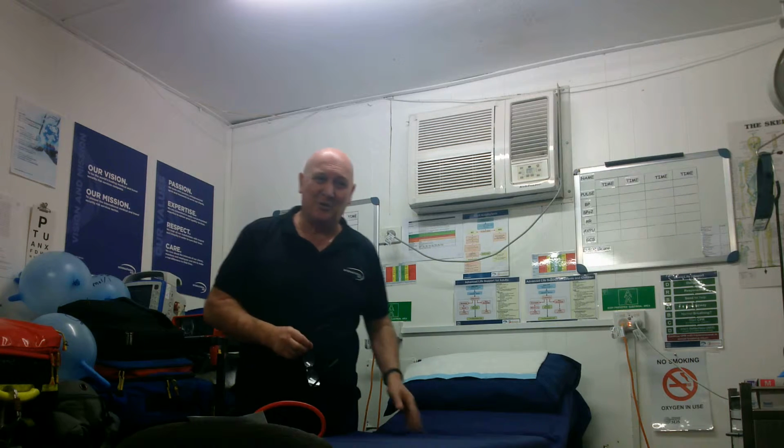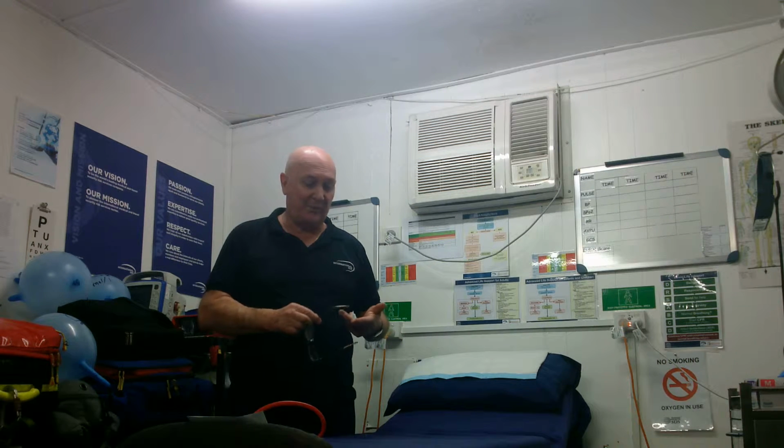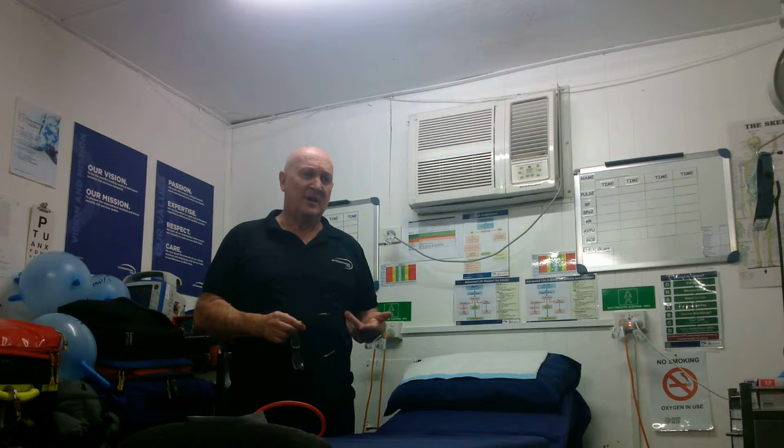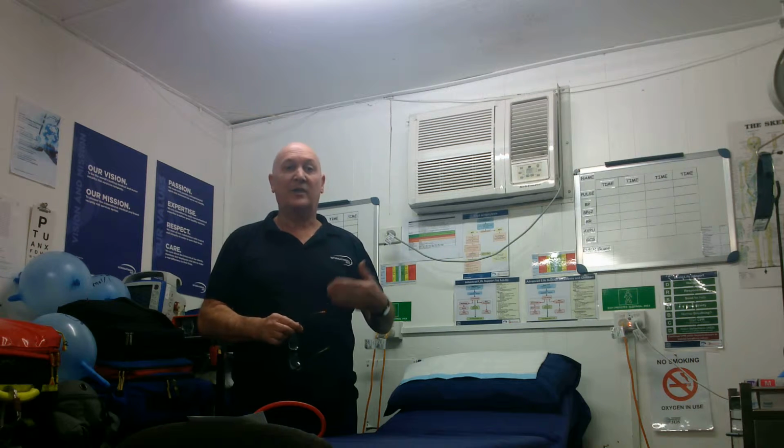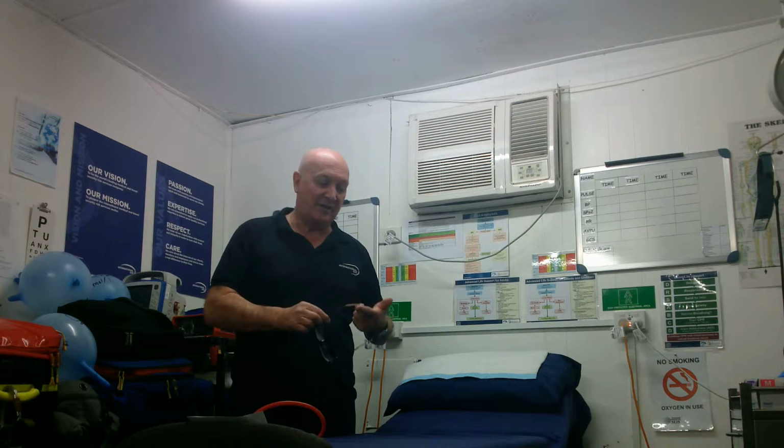So this morning we're going to talk about arterial blood gases. As paramedics, we come in contact with certain patients that may require blood gases to be taken. That could be either arterial or venous. And we've got to then determine our treatment regime, or we pass on the information to our telehealth doctor or receiving hospital. And from there, they can work out a treatment regime in regard to their ventilation, drug therapy, or fluid administration. So why do we do that?